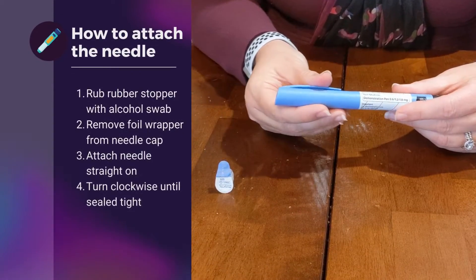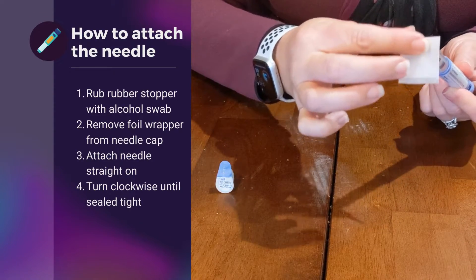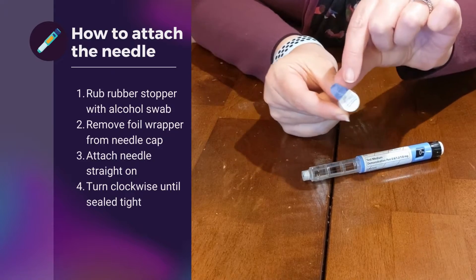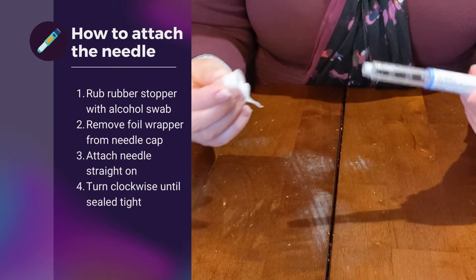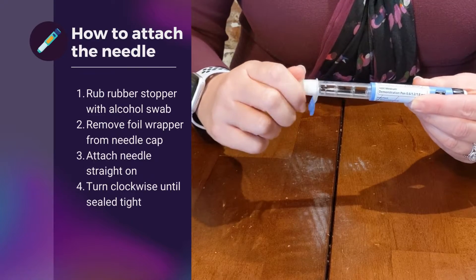We are now going to attach the needle. We will remove this cap, and you want to make sure you have an alcohol swab and wipe off the rubber stopper of the pen before attaching the needle. We're then going to remove this foil wrapper, which exposes the needle. We want to ensure that this goes on in a straight fashion, and then once you feel it grip, we're going to screw it on just like a screw.